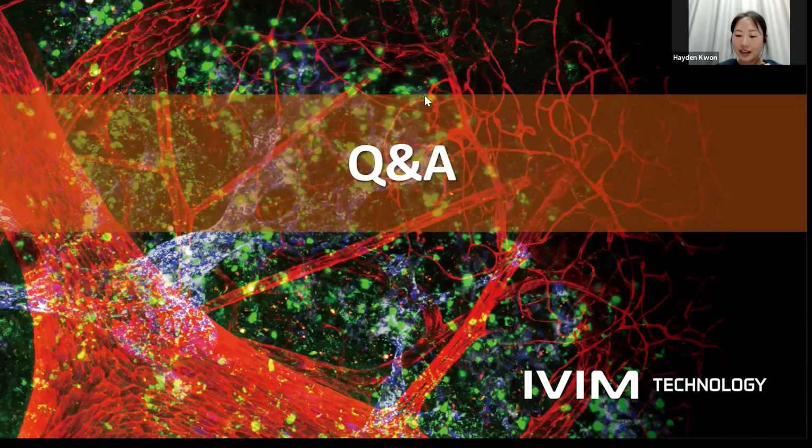Yeah, one of the attendees asked a very important question: the imaging depth. Typically, with confocal laser, we could go deep to around 200 microns. But for red-colored organ imaging, like the spleen or liver, which have many cells inside the organ, maybe 150 to 200 microns. With two-photon, we could go deeper, like 500 microns. For example, the brain is quite white, not red, so in that case we could go around 700 to 1000 microns.